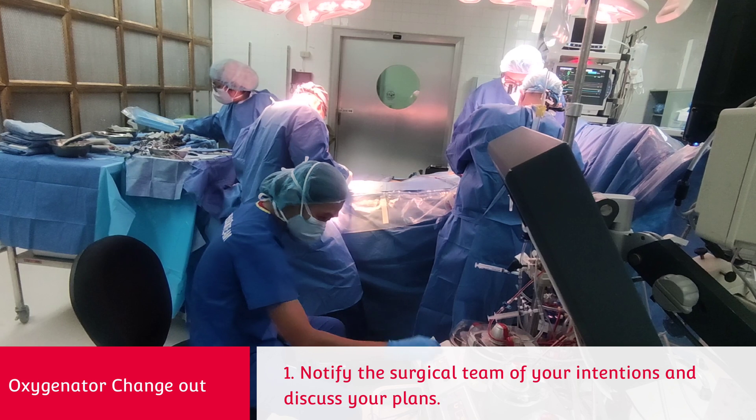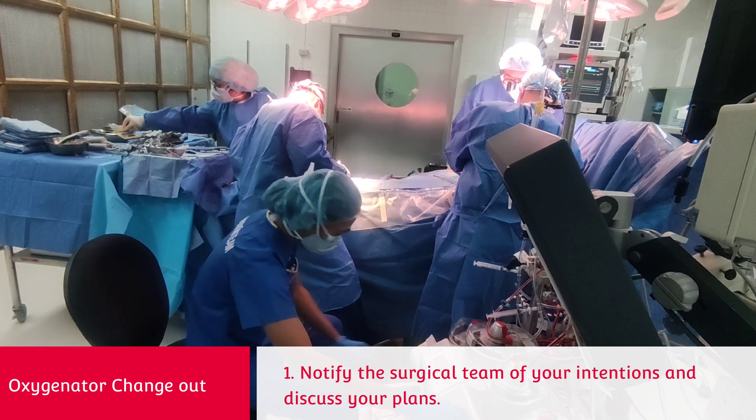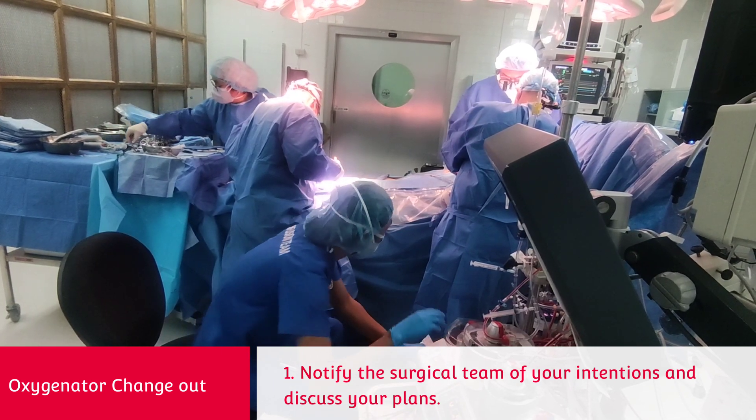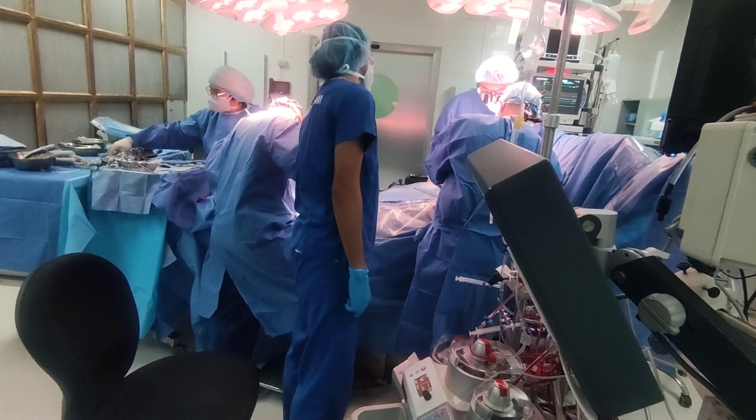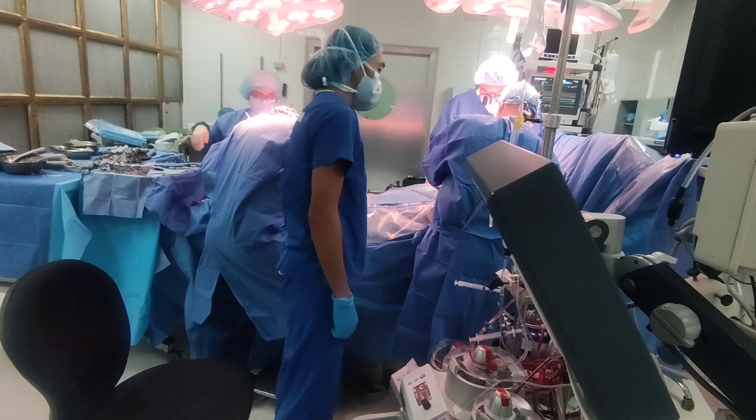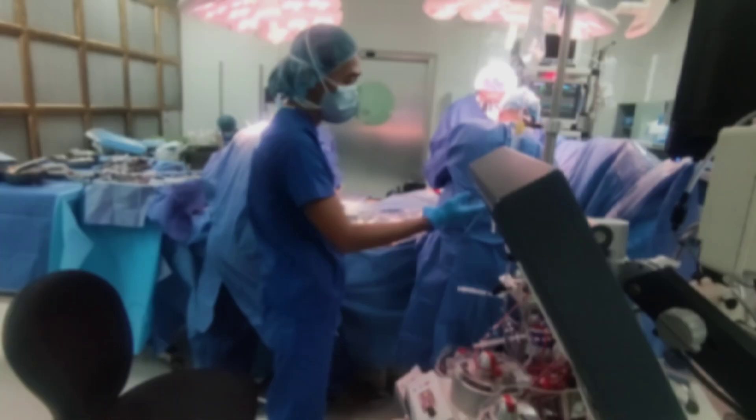You must notify the surgical team of your intentions and discuss your plans. If possible, terminate CPB and remind anesthesia to ventilate. If change-out during bypass is unavoidable, then the following protocol should be observed.